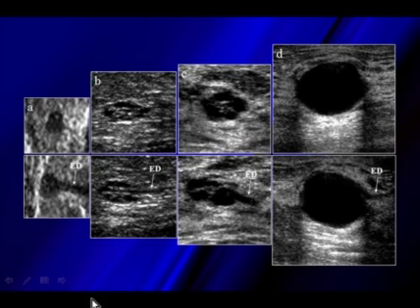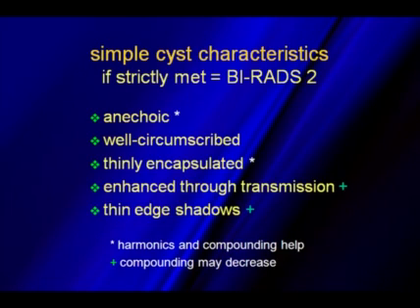So here we can see ultrasounds of a normal TDLU. Here's one that has gone through some cystic change or some microcysts of the TDLU. You can see the cysts have gotten a little bit larger, all the way up to a tension cyst. These are the same lesions, but just rotating around and finding the normal extralobular terminal duct that goes into the TDLU makes you much more confident that you're actually dealing with a cystic lesion or cystic change of the TDLU.